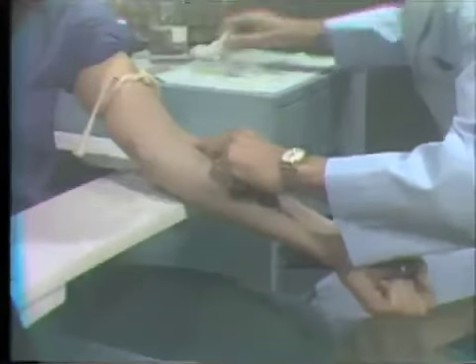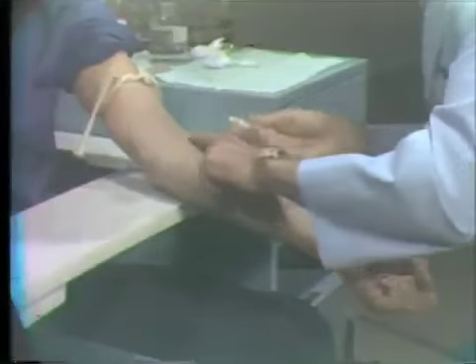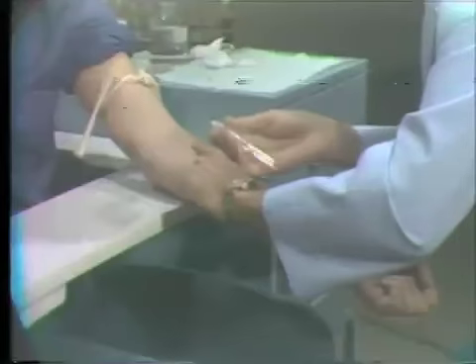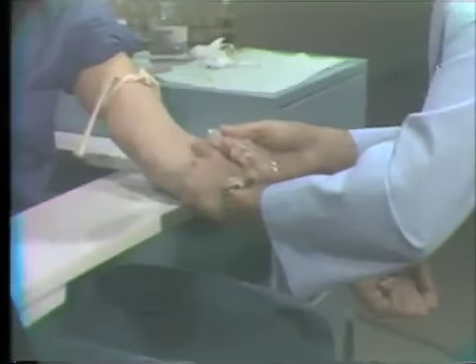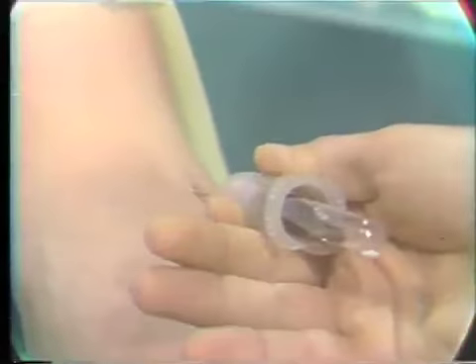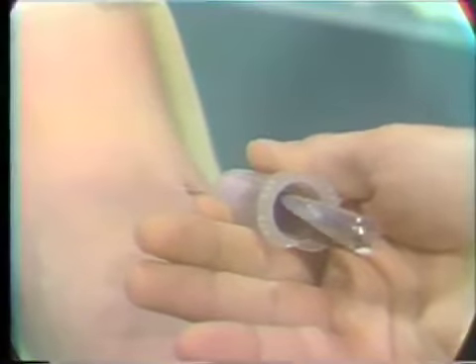We'll dry off, take our Vacutainer, have the bevel up, pull the tissue tight, needle bevel up. Get yourself a rest position so that my hand holding the needle is resting on the patient. I then go right above the vessel, directly into the vessel. Now, the blood does not come into the Vacutainer tube until it is engaged. By engaging it, I merely press it so that the vacuum is coming and the blood fills up.